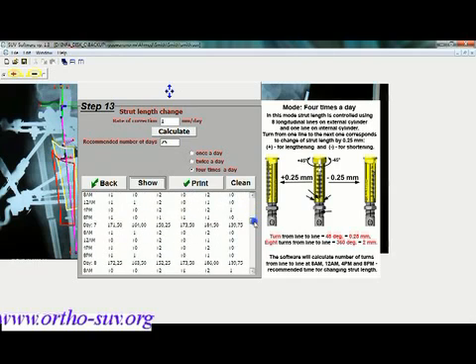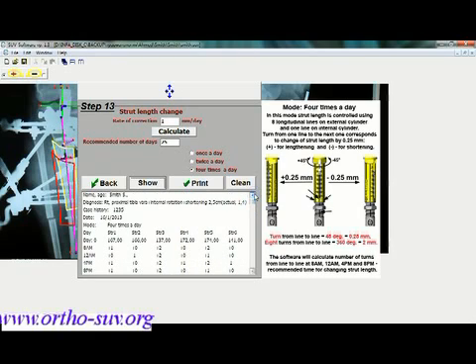You see it's for each day, in numerals showing how many millimeters it was at the beginning of the day and at the end, and in quarter millimeters to change strut length according to the black lines we had spoken about in previous lectures.